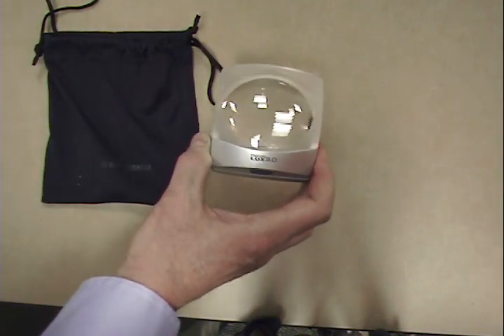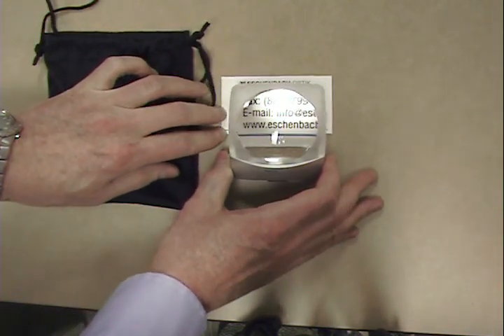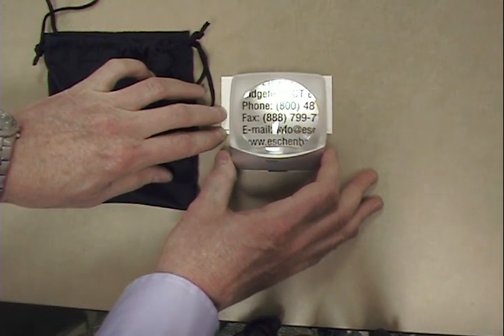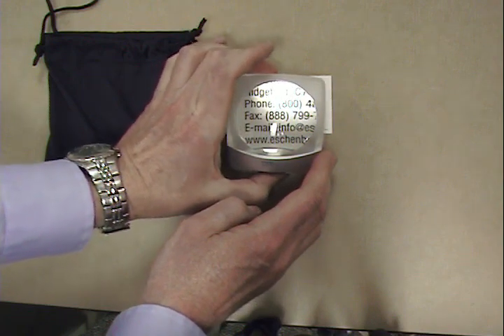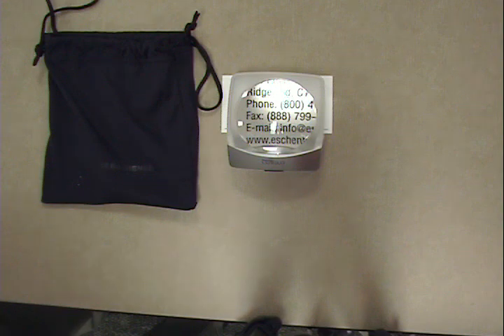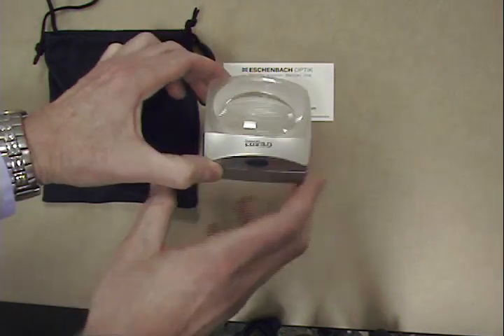For more information on the Minus Lux or to have it demonstrated in your office, please call your territory manager or our customer service department at 800-487-5389. For quick facts about this product, go to our website at www.eschenbach.com. Thank you.